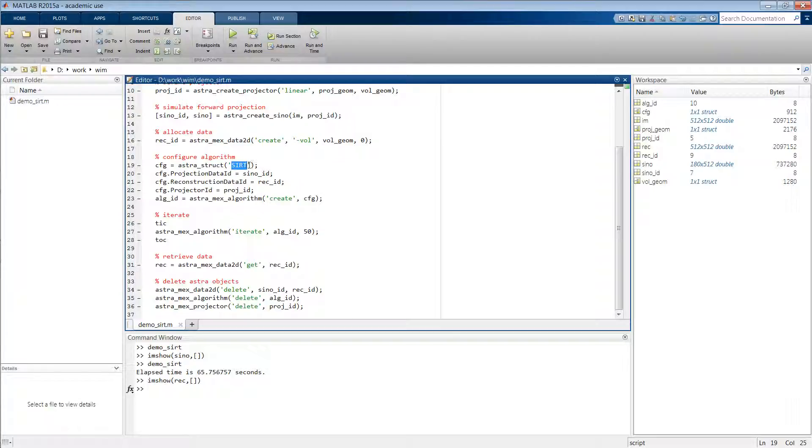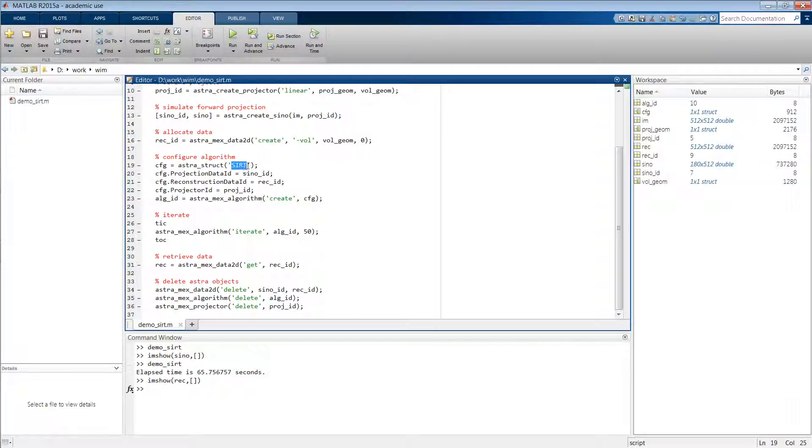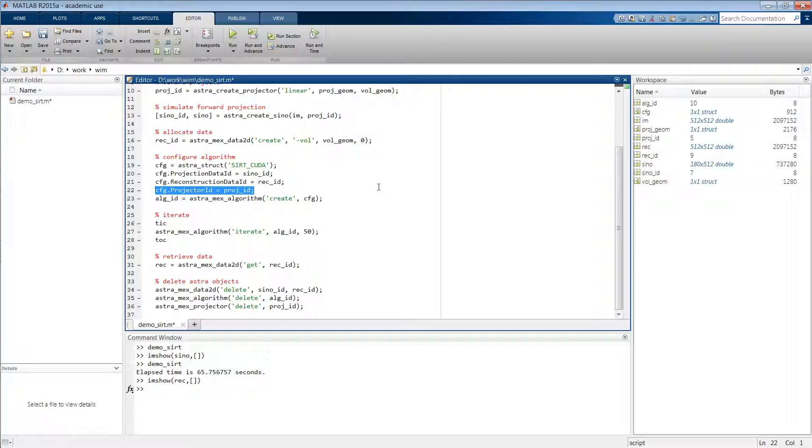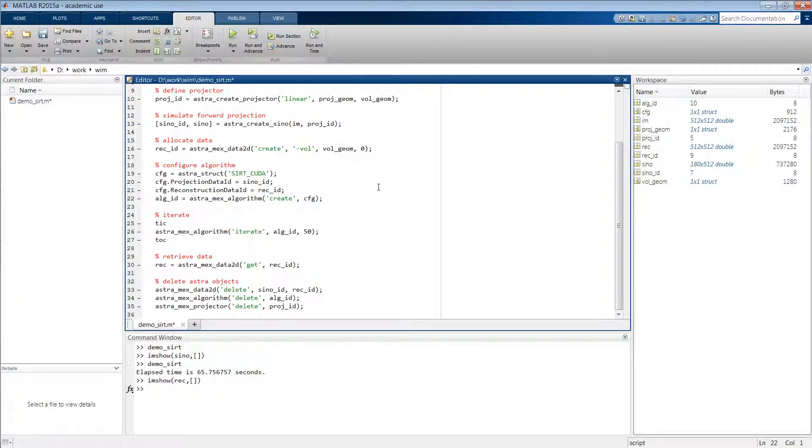So let's see what we have to do to use this CUDA version. And effectively it is very easy. So instead of configuring a SIRT algorithm, you will be configuring a SIRT_CUDA algorithm. And then as far as the options go, you just have to delete the projector ID, because in the CUDA version of the toolbox the projector is built in into the algorithm, so it cannot be specified by the user. And this is then already sufficient.